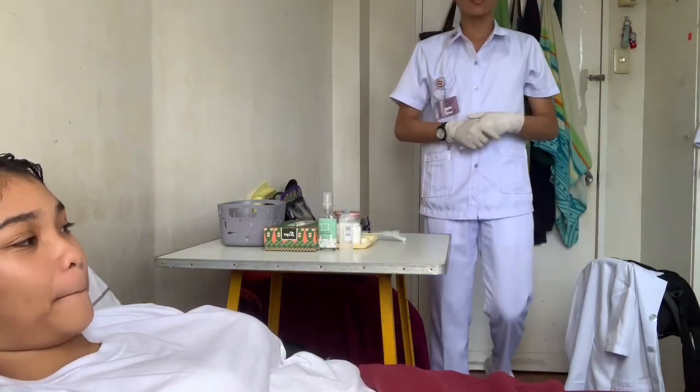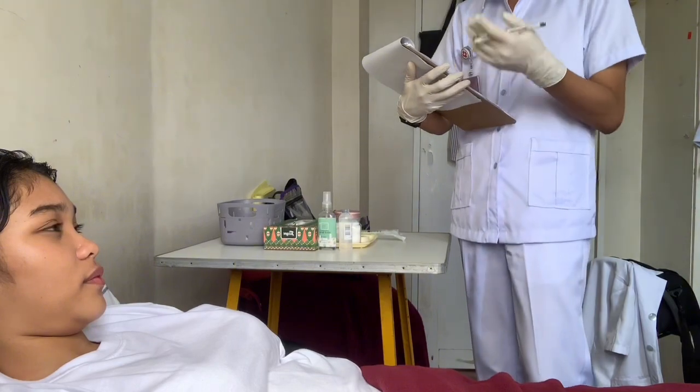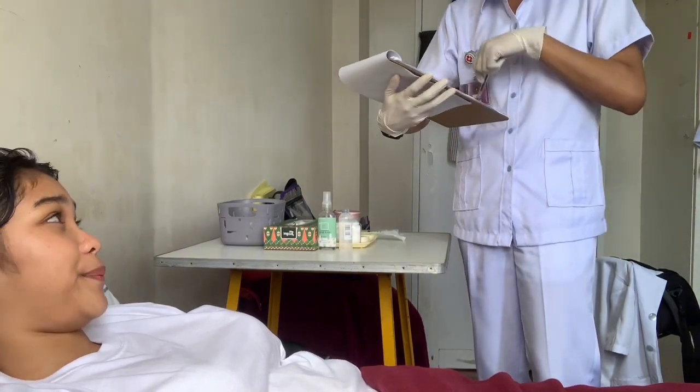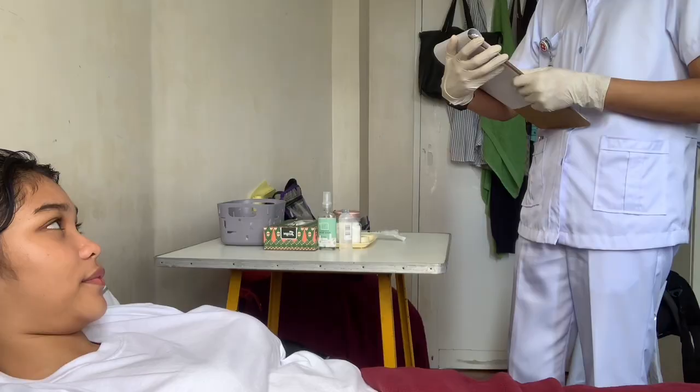So now, if bleeding occurs, then apply pressure with the use of dry sterile gauze or cotton balls. So ma'am, since we are done, how are you feeling? Okay, so good. So I'm going to head out now. You may rest. And if you need anything, don't hesitate to call me using the call button, okay? Before we end this, do you have any questions or clarifications? None? Thank you so much, ma'am, for your time and cooperation, and have a nice day ahead.